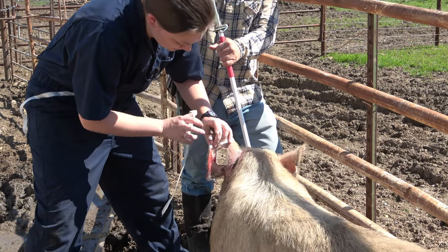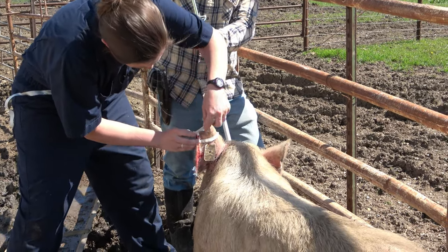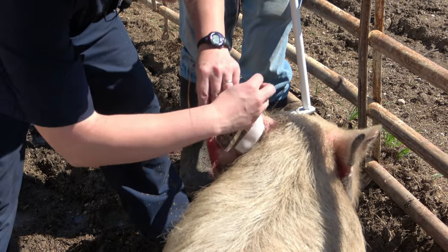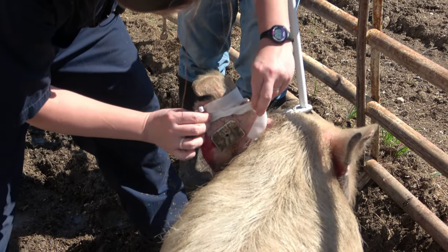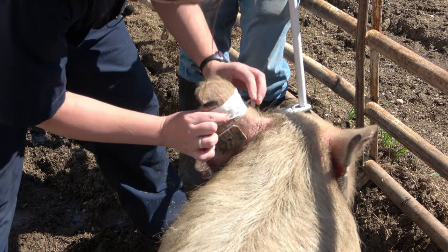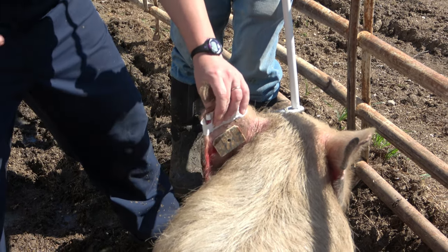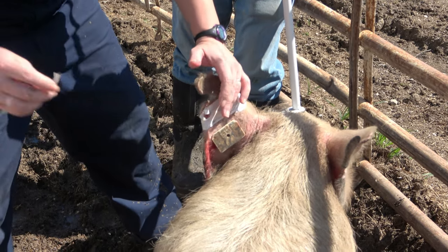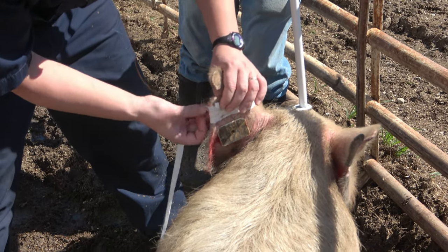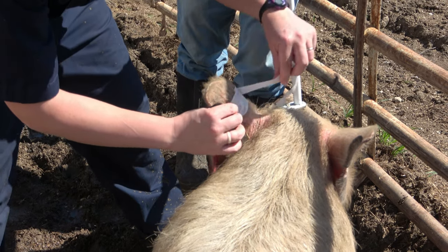And as you can see, it's a little bit trickier to tape these in with the ear being just flat like this. But we'll get around our ear as tight as we can and get our thick piece of tape on. And she is awake and a little wiggly, so it's not the most beautiful tape job I've ever done. Then I like to take a little thin piece of tape to keep my cap in place separately. So if I need to change the cap for any reason, it's taped in separately from my catheter.